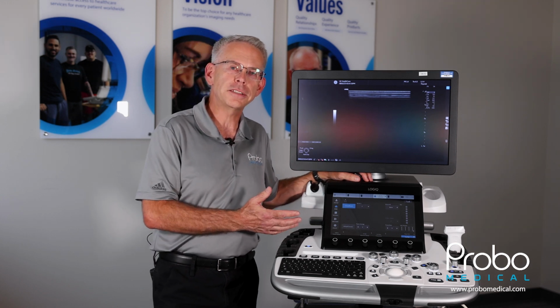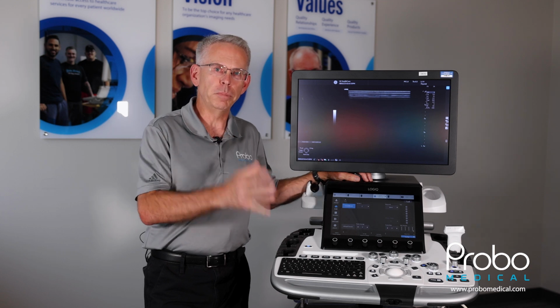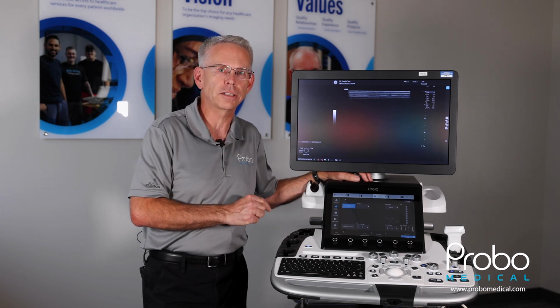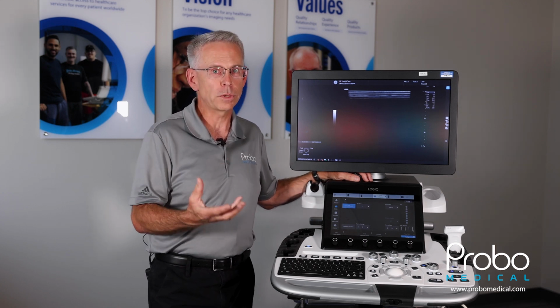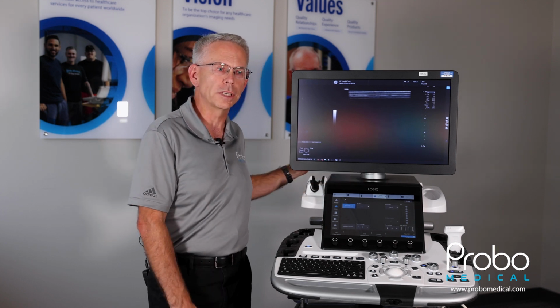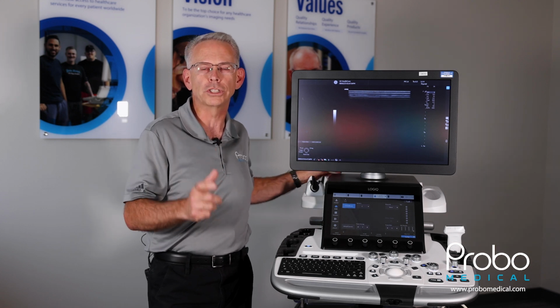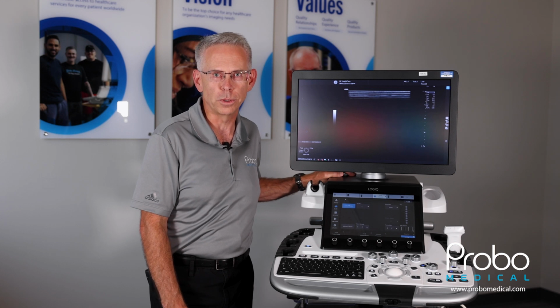Logiq E10 and setting up DICOM networking. So before we really get started into the button pushing, we need to talk about how you are going to physically connect to your DICOM network. That would either be through an Ethernet cable, and if you're going to connect through a hardwired Ethernet cable, you just plug into the back of the Logiq E10 and then into the appropriate wall jack on your computer network that your IT department has determined for you.